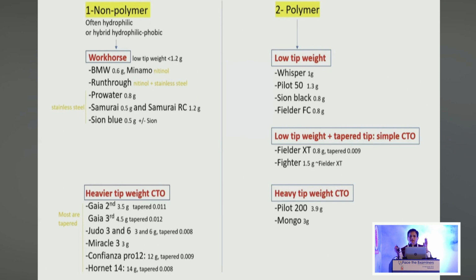So basically there are two axes. One is lubricity, and the penetrability is maximum with a polymer wire. The moment you have a hydrophobic or non-polymer wire, the lubricity goes out, but you get tactile feedback. So it's basically a play between the two: whether you want tactile feedback, or you want deliverability and lubricity to really get through. You will understand once you start doing it what exactly you are looking for in that particular procedure.